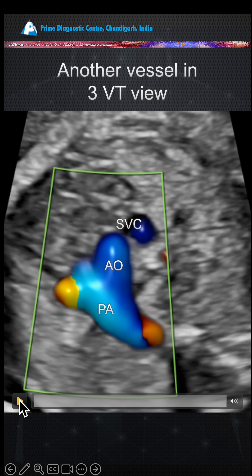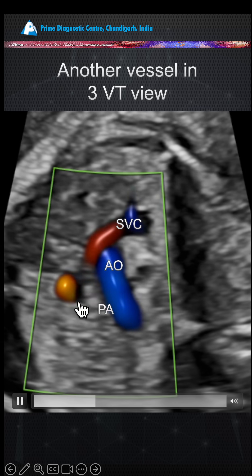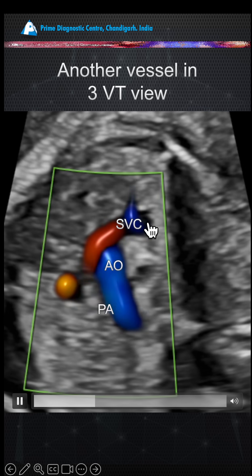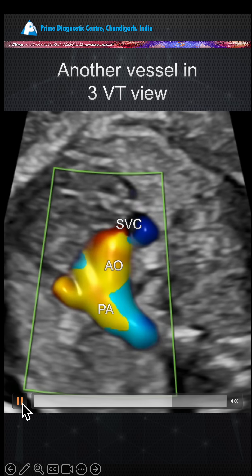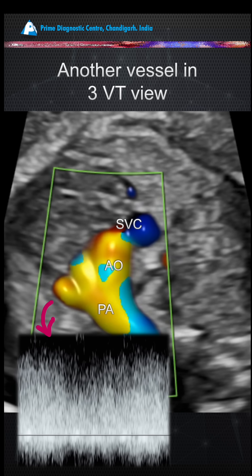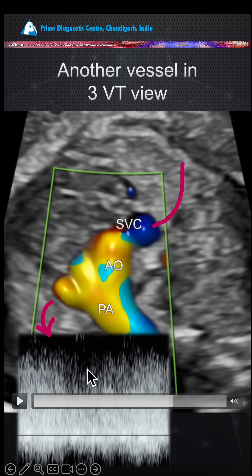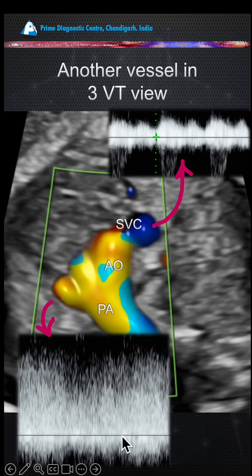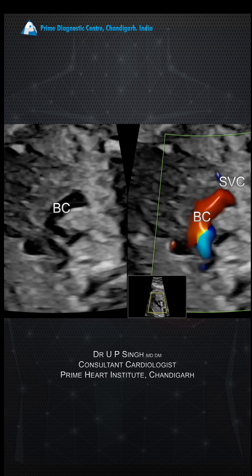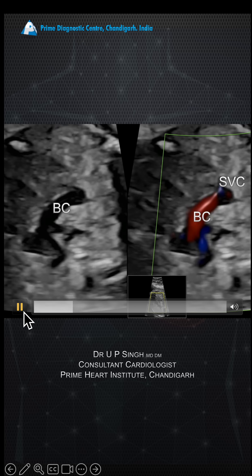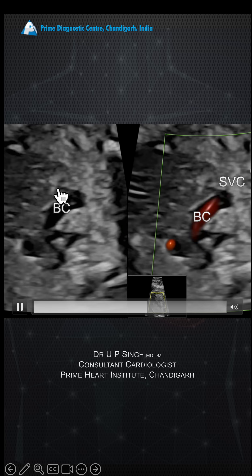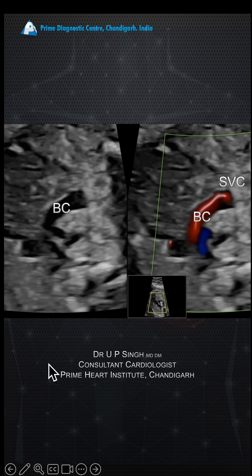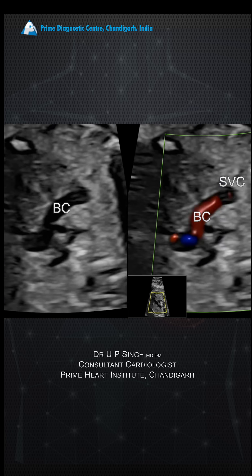This is an interesting case. What you see here is two vessels with one additional vessel in a three-vessel trachea view, but the colors are different — one is blue and one is red — which gives you an idea of flow direction. The flow is definitely abnormal and doesn't look like a superior vena cava flow, so there's something wrong. This is not a left SVC. What you see here is a brachiocephalic vein which is dilated. Normally in a left SVC, it should be either absent or small.